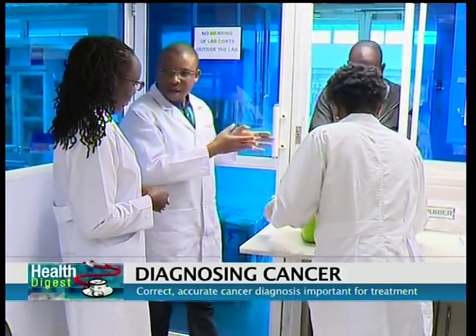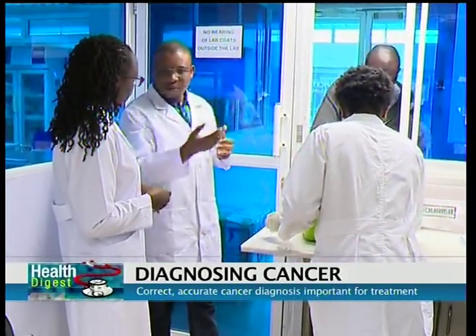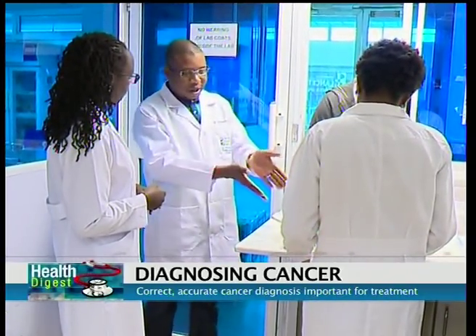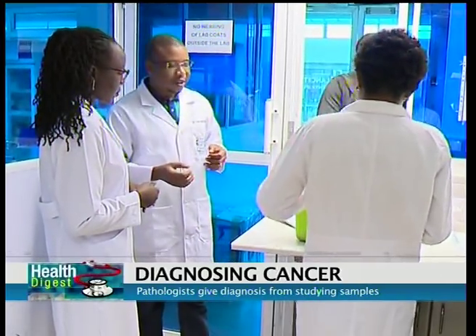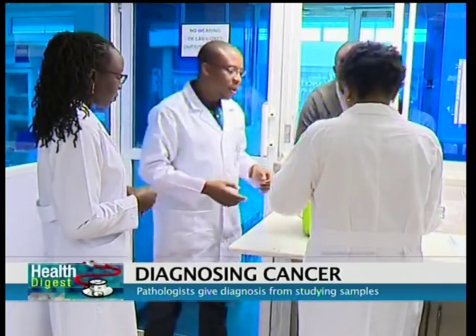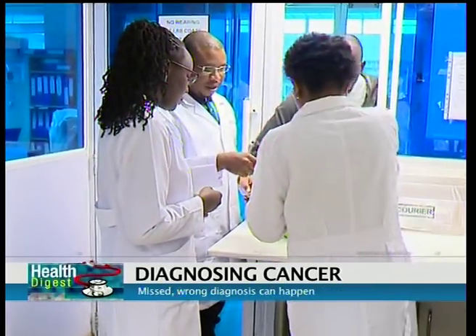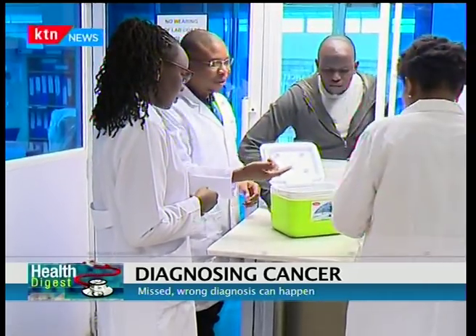That's why you spend a lot of time making sure that all the processes in the lab are as foolproof as possible. So what we call clerical or human errors, pre-analytical errors. The samples will be brought by couriers or messengers from the courier delivery company. When they come, they typically come in a container like this, in a cooler box, or in small boxes. Now, I think this one has a fluid sample. Yeah, it also has a tissue biopsy.